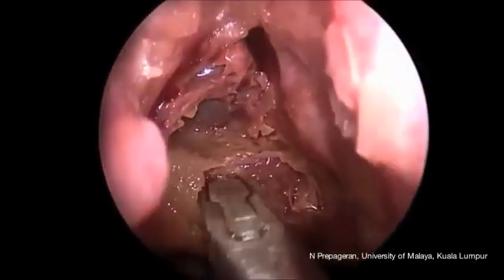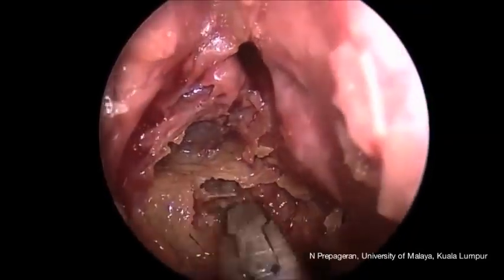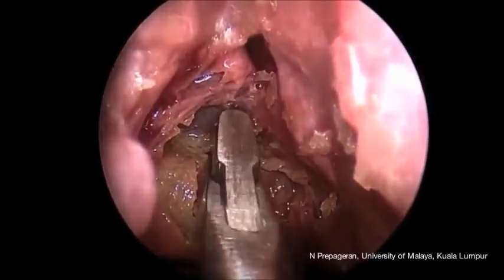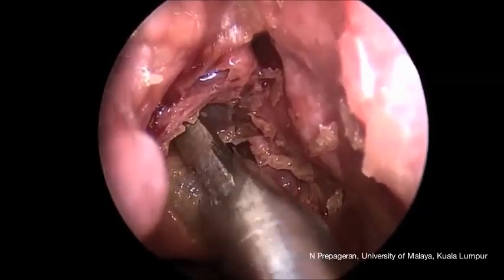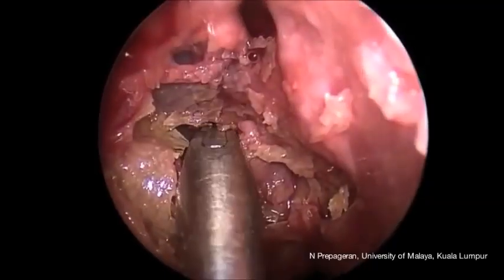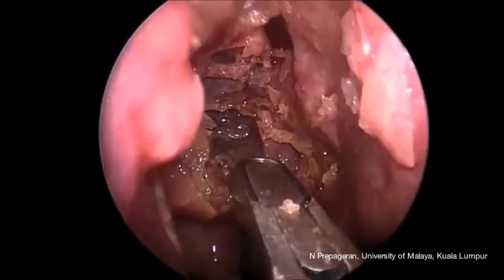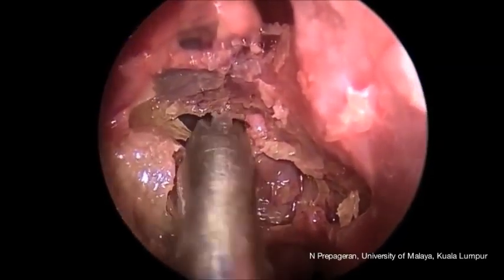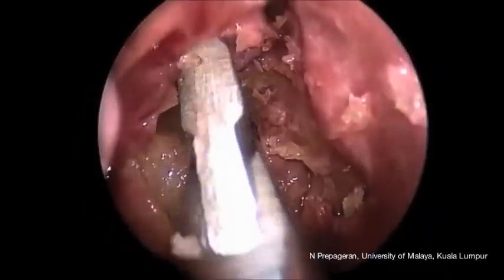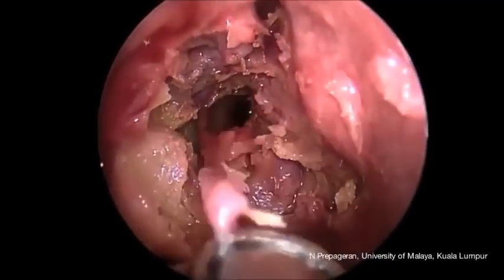And once we know that there's an air cell, then you can excise the ground lamella quite nicely and expose the posterior ethmoids. The posterior ethmoids usually will have larger air cells, but a single air cell. You can do this part either with a powered instrument, or you can use simple through-cutting forceps, or cutting forceps, which is what I'm doing right now. You can see now we are already in the posterior ethmoids. So I'm removing the ground lamella completely so that we are able to visualize the entire posterior ethmoids.